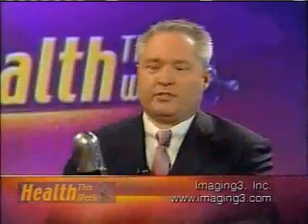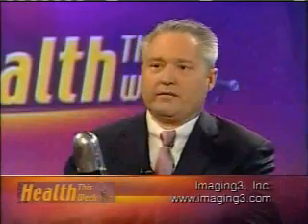Now, I was wondering about that because we looked at some video of the unit, and of course it is a much larger opening, and it's not a tube, it's more like a ring, so to speak. But there's no beeping and buzzing and clanging, the kind of things that we normally get in an MRI? No, it's a silent system. You pretty much don't know any imagery is being taken other than the physician showing it on the monitor.